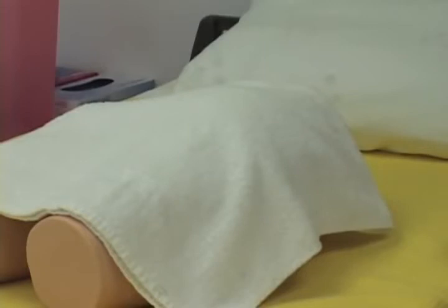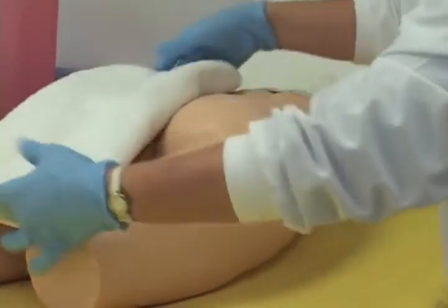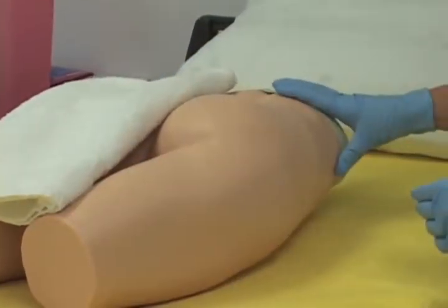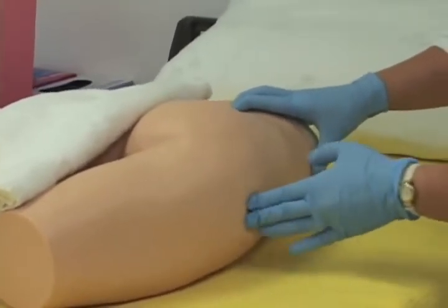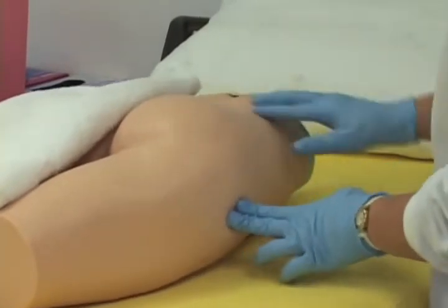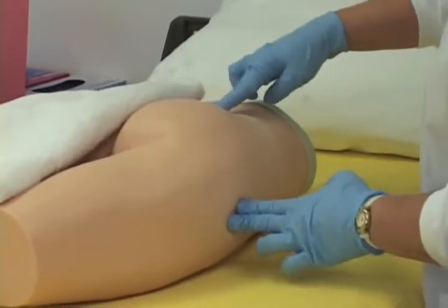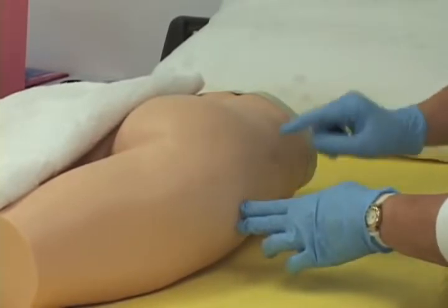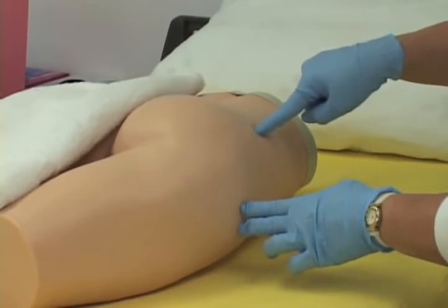We will begin this procedure by demonstrating the 3 IM injection sites, beginning with the dorsal gluteal site. You will need to choose and identify the intended injection site, including the bony landmarks and the name of the muscle. For dorsal gluteal, first locate the greater trochanter. Place your index finger or fingers on the greater trochanter. Find the posterior superior iliac spine. And you put a finger or two on the posterior superior iliac spine. Now draw an imaginary line between these 2 landmarks. In the middle of that imaginary line, you're going to go up about 1 inch, and this is your intended injection site.